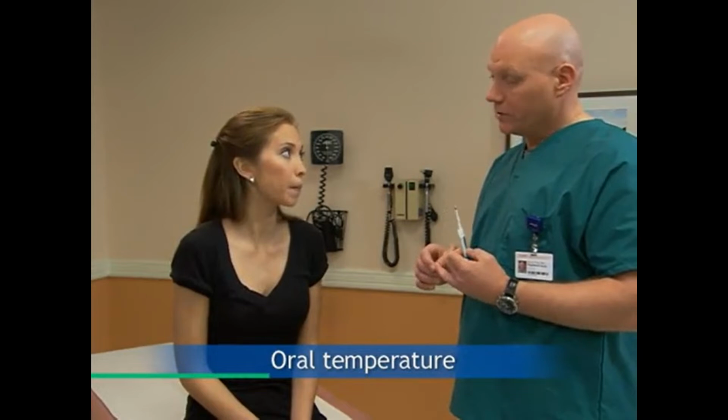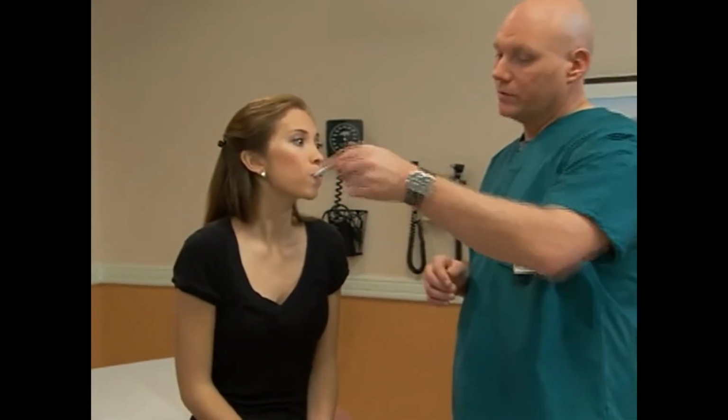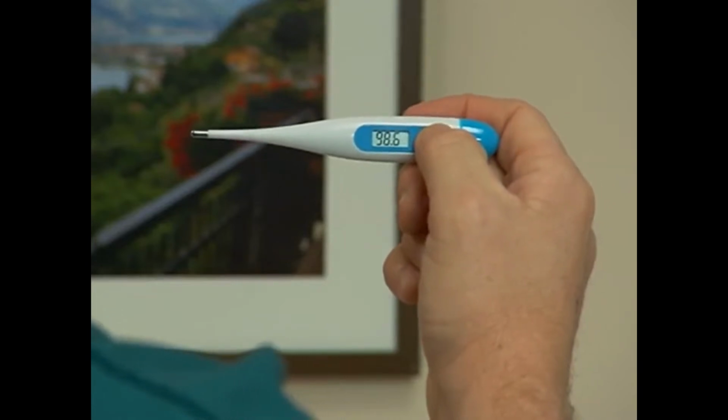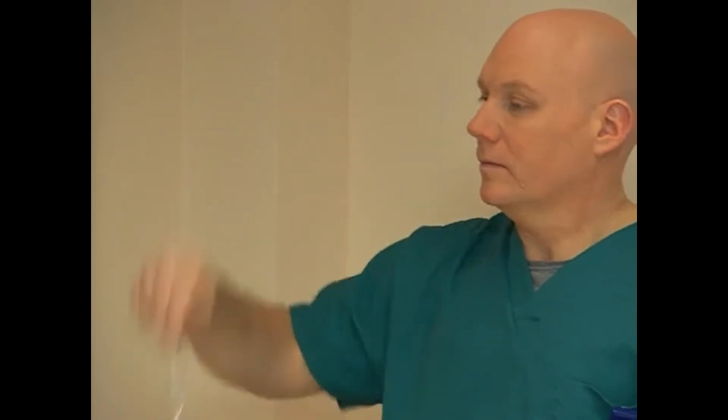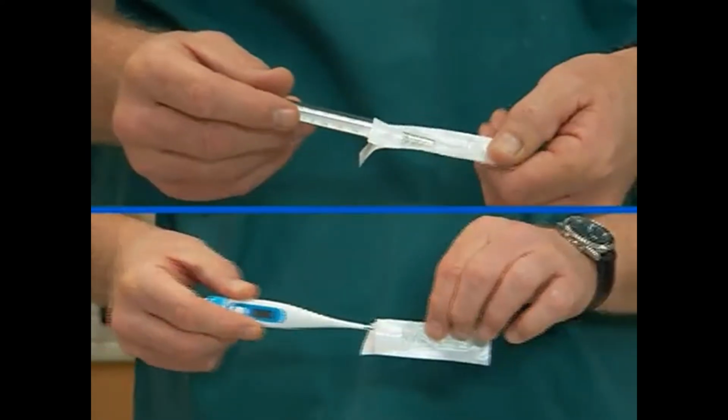To prepare for taking an oral temperature, first make sure the client has had nothing cold or hot to eat or drink and has not smoked or chewed gum for the past half hour. If using an electronic thermometer, turn it on, making sure the battery is fully charged. If using a glass thermometer, shake it down to move the contents below the level of 35.5 degrees Celsius or 96 degrees Fahrenheit. Cover the tip of the probe.